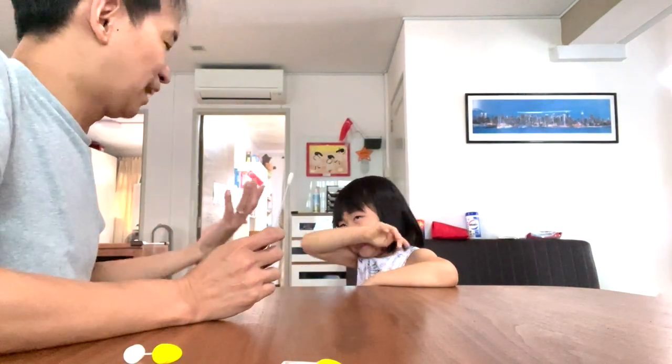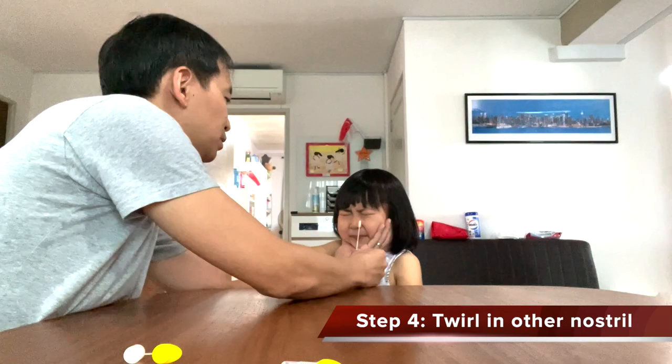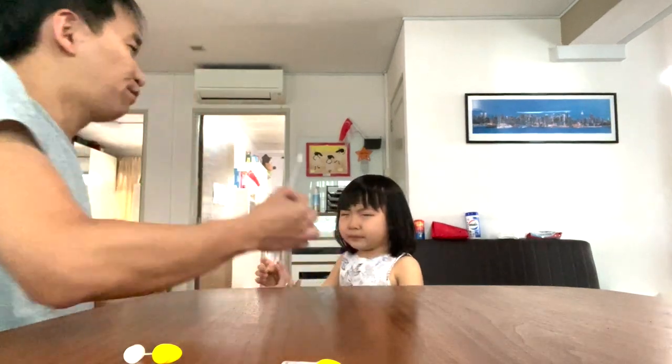You can take a deep breath now. The other nose also five times: one, two — three more times. You can see tears flowing out. One, two, three, four, five. Finished.